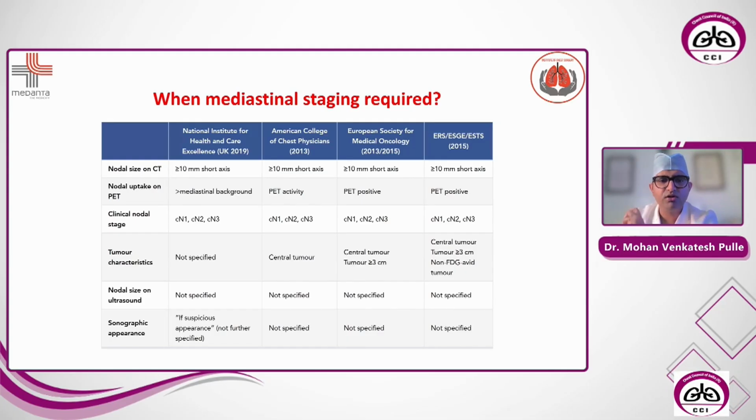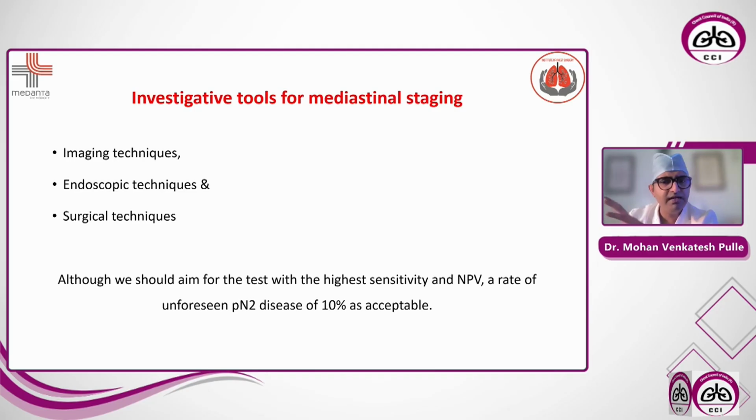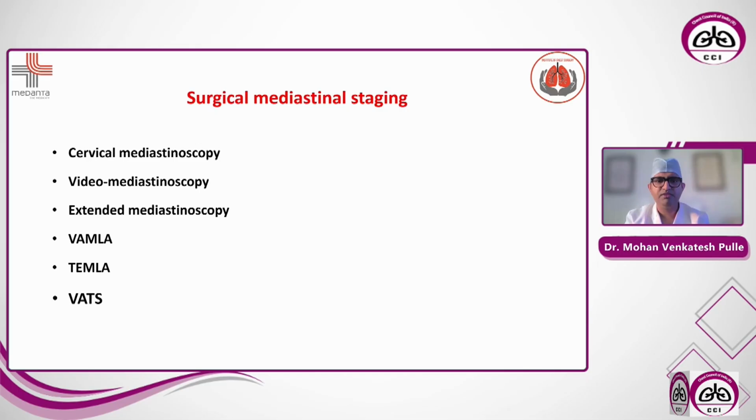And the next question comes, what are the investigative tools for mediastinal staging? We have imaging techniques, endoscopic techniques, and surgical techniques. Although we aim for the best of the tests, the test with the highest sensitivity and highest negative predictive value is the most important test in mediastinal staging. However, a rate of 10% unforeseen N2 disease is acceptable in lung cancer staging. So first I will discuss how a surgeon can assess the mediastinal staging.